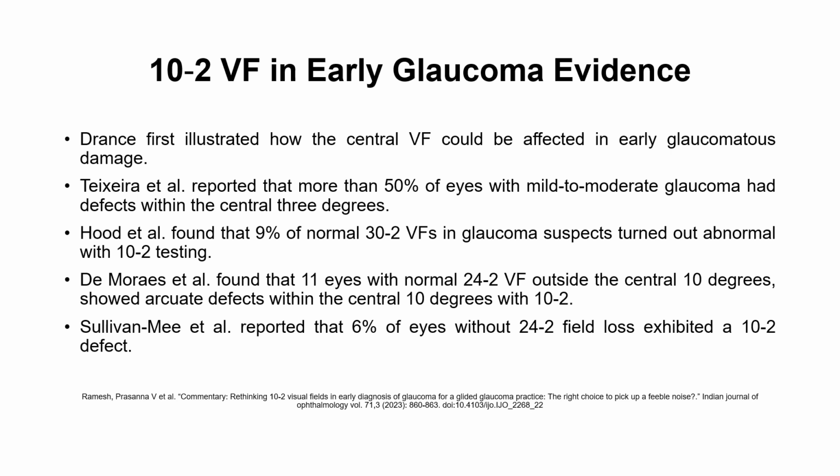And Sullivan and his colleagues reported that 6% of eyes without 24-2 field loss showed a 10-2 defect. So it's clinically evidence proven.